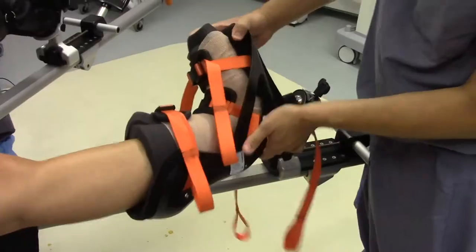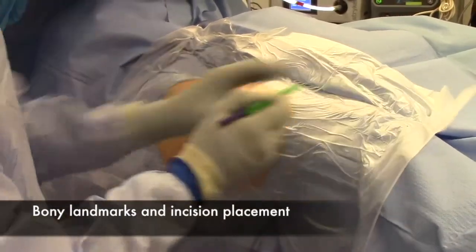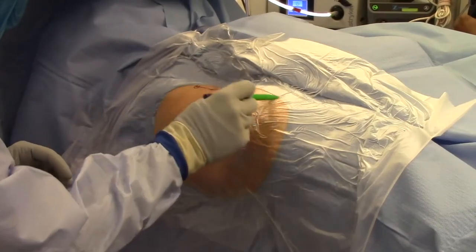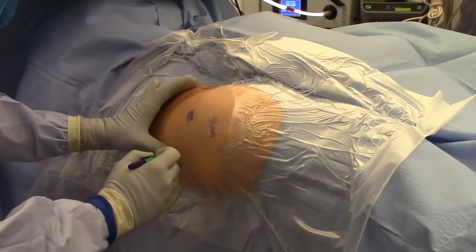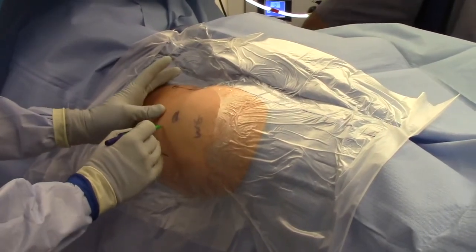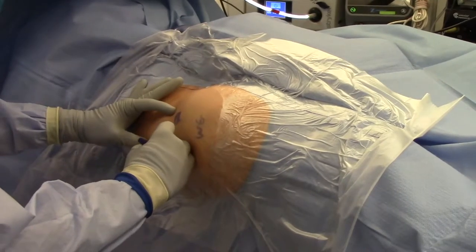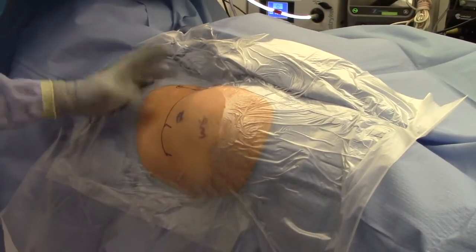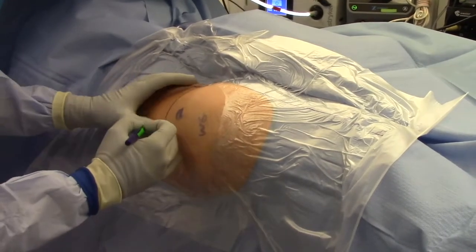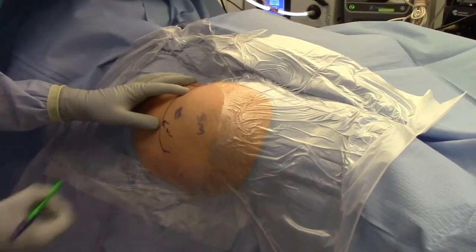The landmarks for hip arthroscopy are as follows. The ASIS and the patella are the landmarks to create a vertical line on the leg. Second, find the greater trochanter and mark the back and the front of it to accurately place your portals. A transverse line drawn across the tip of the greater trochanter, which intersects with the vertical line, will show you the safe zone for hip arthroscopy.